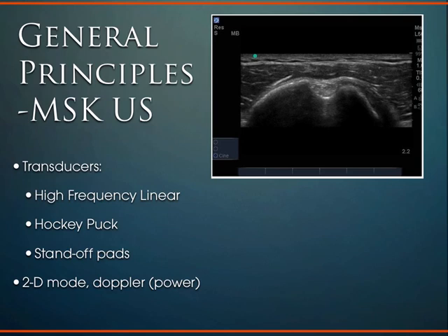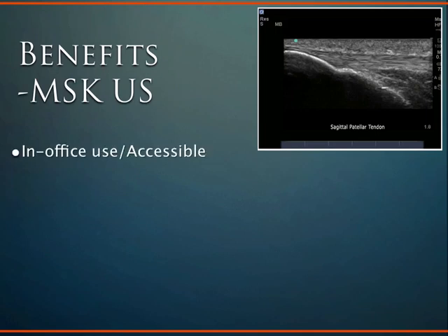And in particular with pathology and different injuries, you're going to see differences in terms of new vessel formation and things like that with some of these tendon disorders. And so in general, we're using a power Doppler mode.